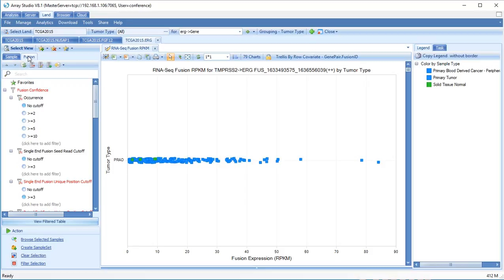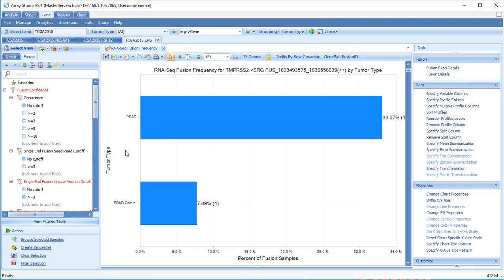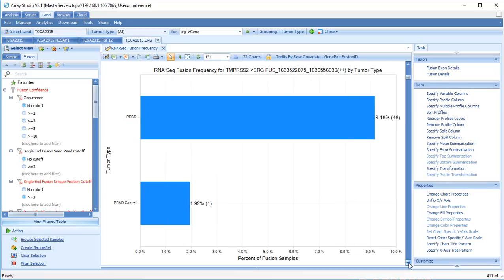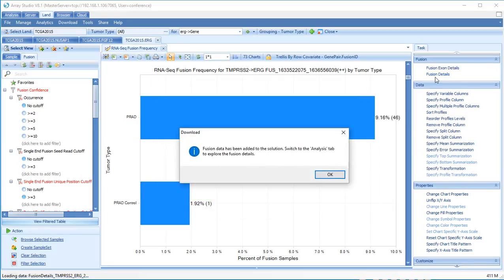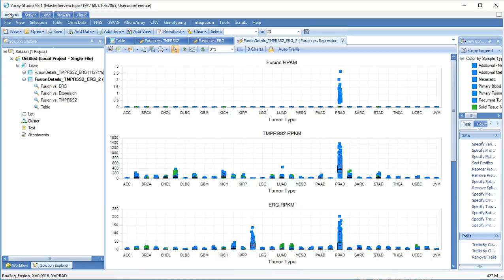Now click the Fusion Site Frequency view. This displays the frequency of each fusion in different tumors. Several fusion events occur frequently in PRAD tumors. Details of a fusion event can be viewed by clicking Fusion Details in the View Controller. This downloads expression data to the Analysis tab, where we see the expression of each gene involved in the fusion as well as expression of the fusion gene grouped by tumor.